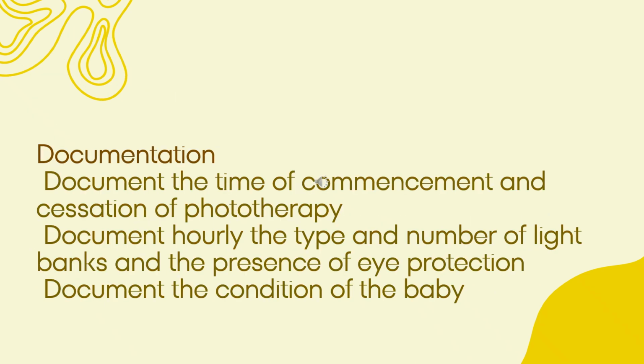Documentation. In the documentation, record the time of commencement and cessation of phototherapy. Document the hourly, type and source of light and number of lights, presence of eye protection, and the vital signs, and the general condition of the baby.